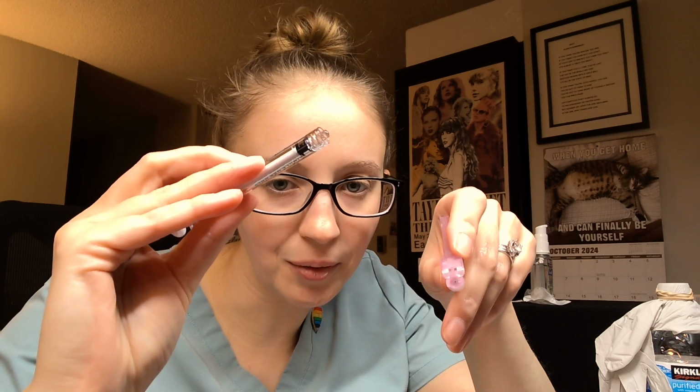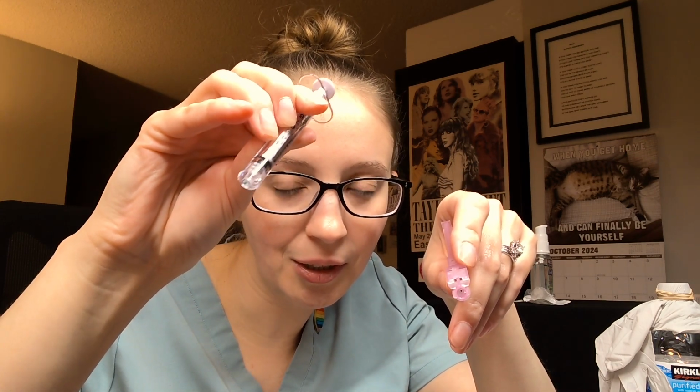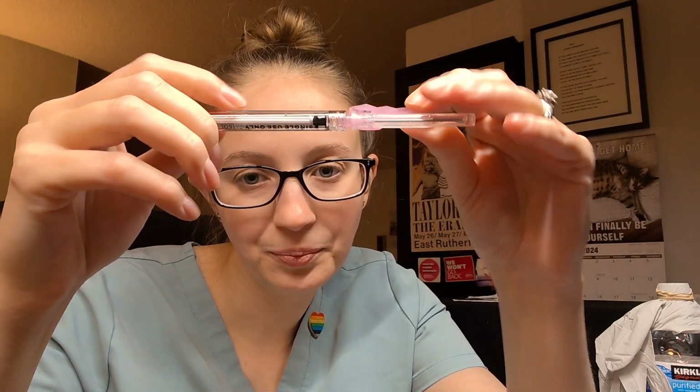To attach your 18 gauge needle, you're going to notice the end of the syringe has a little cylinder on it in the middle, and there's a little hole in the needle. So you're going to take the hole of the needle, line it up with that cylinder, push down, and then you twist. Just like that.